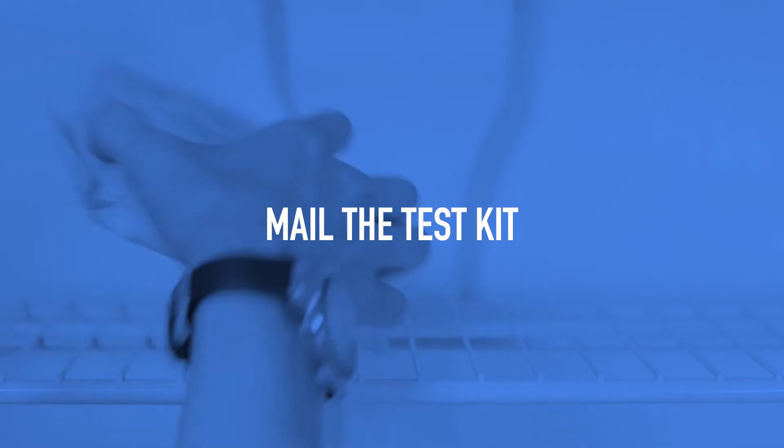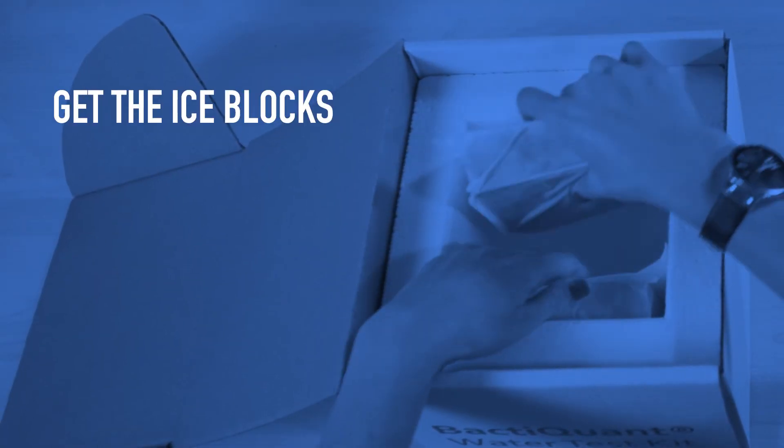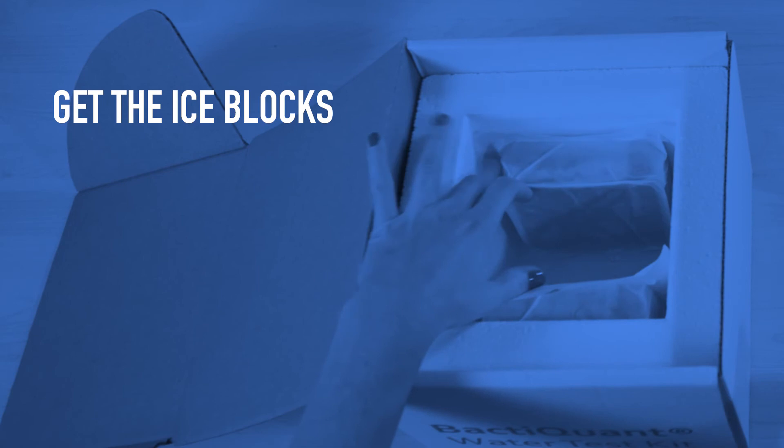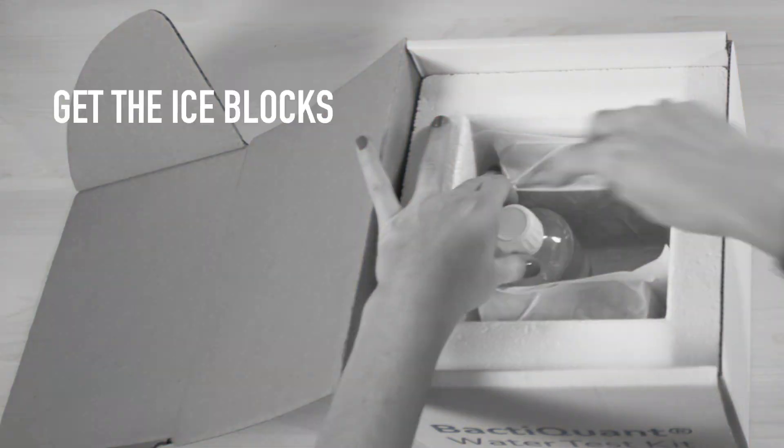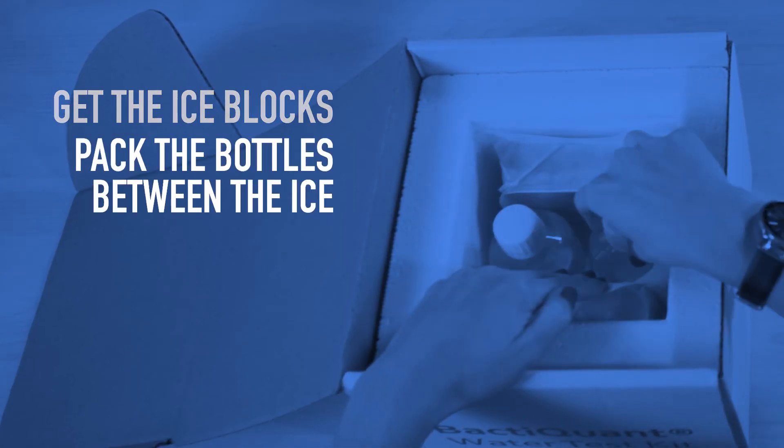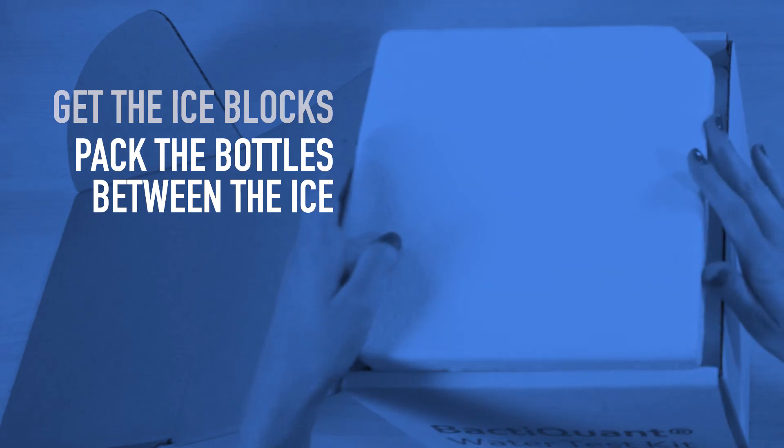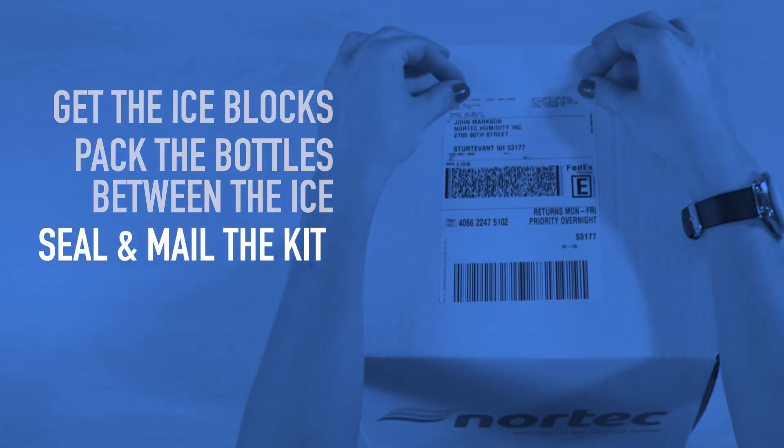Once your water samples are ready for shipping, remove the ice blocks from the freezer and pack them into the styrofoam cooler that's part of your kit's original box. Place the water samples in between the ice blocks and then immediately mail the kit using the shipping label that came with your test kit.